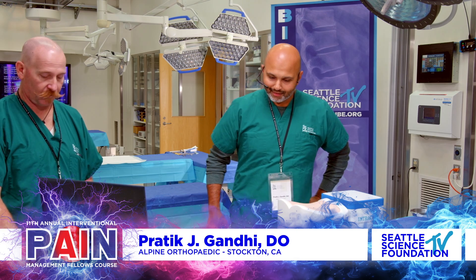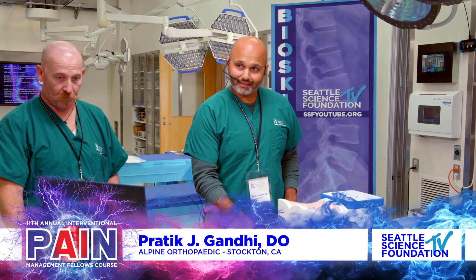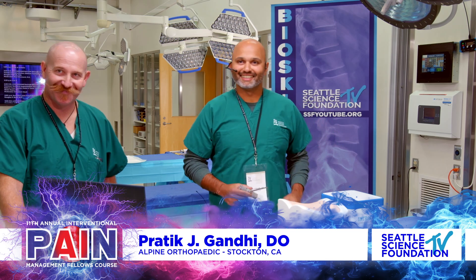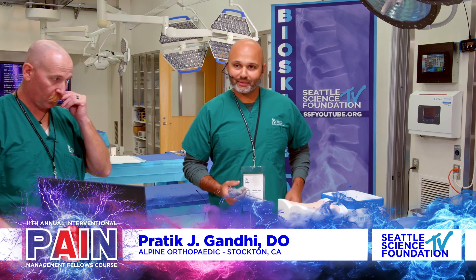We're going to segue into demonstration for basal vertebral nerve ablation with Dr. Pratik Gandhi. We have the model - no lead, no radiation. This is the radiation-free version of basal vertebral nerve ablation.